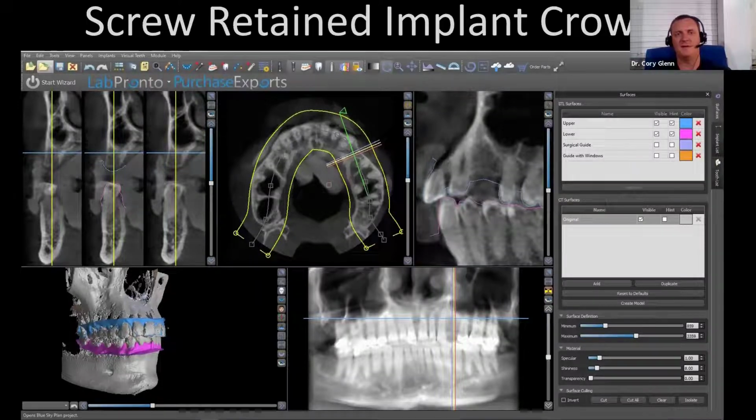So I said, well, let's do an implant on our buddy. So we just decided to do this. Now, the only kicker is that he was moving to Hawaii just a couple of weeks after we placed this implant, so there's not going to be any recall on this. And since he was getting it for free, we thought, what the heck, let's go ahead and just place the implant and restore it with the final restoration all at once. And so that's kind of where this case is going.